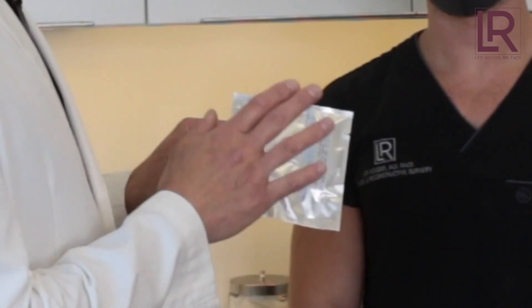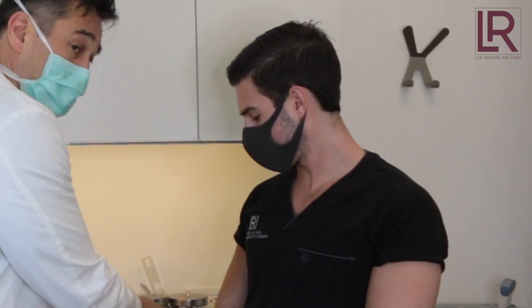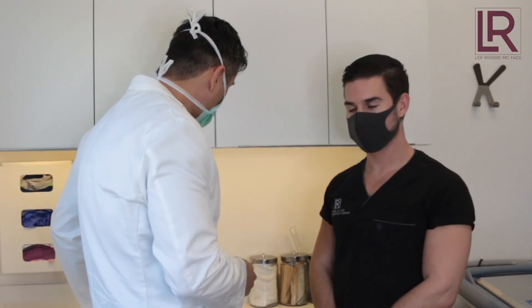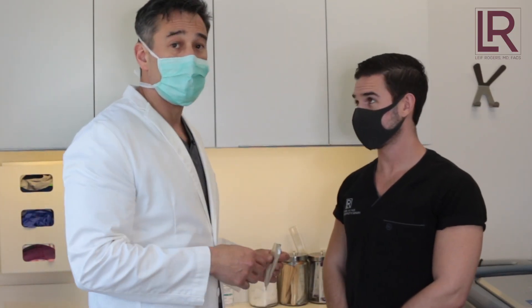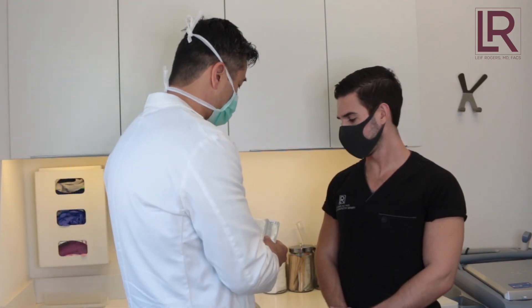The tests come in little packs like this — there are different brands. Nick here has never been tested. There are actually quite a few people who are apparently immune because they've been exposed and didn't even realize it, since they had such minor symptoms. We all hope that's us, but we will see today whether Nick has been exposed.